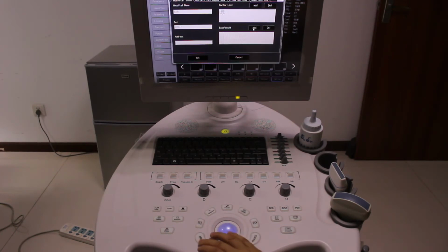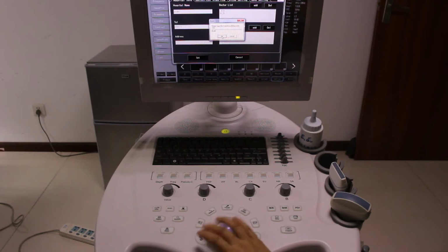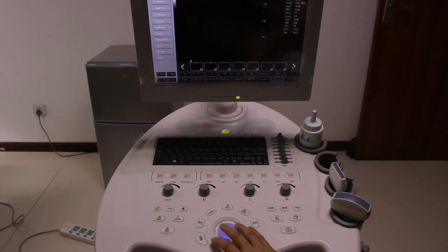Exam result, maybe for the same diseases, you can have the result. You can add the same sentences here, then set. All of the information that we just filled in will be shown on the report.